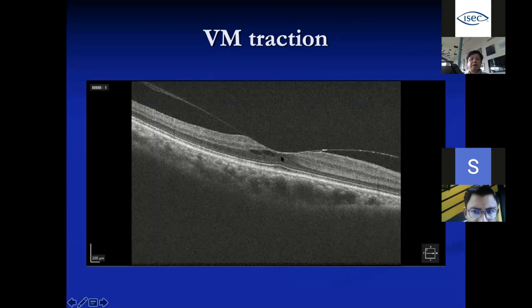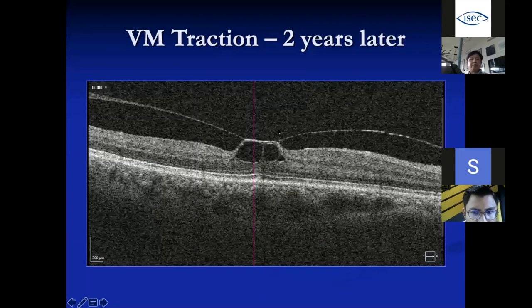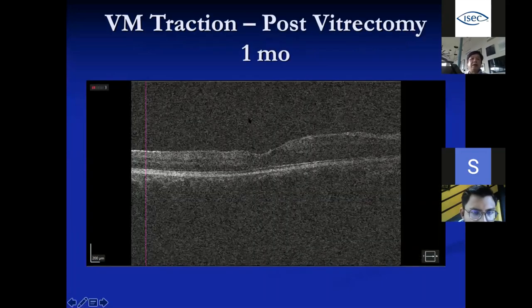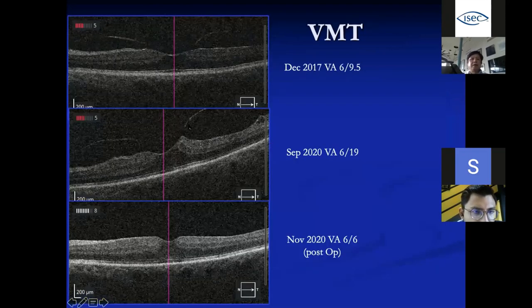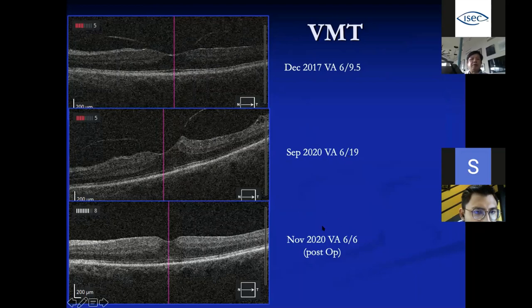If not symptomatic we watch; if symptomatic — losing vision to 6/12 or worse, or having distortion — we'll proceed to surgery. In one patient, we watched over two years as the traction was still pulling on the retina, and once they became symptomatic, we performed a vitrectomy. One month later, there was no more traction on the retina. Another patient with 6/9 vision: we watched three years before he became symptomatic, then performed operation. By September 2020, vision was restored to 6/6 with no more traction.